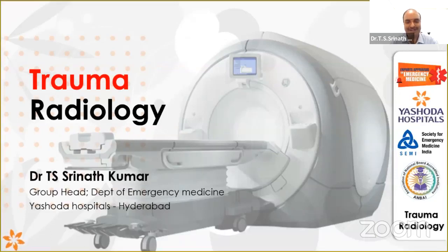But what is important for us is, after all these things, what next? Because we are emergency physicians, we should know what next we have to do, how to stabilize the patient, what things we have to do next. The progressive use of contrast enhanced CT allowed for a better assessment. I'll give an example. We had a polytrauma patient last week. There was a dilemma whether this patient should proceed with a normal CT or a contrast enhanced CT. But we went on and did a contrast enhanced CT, and we could see the difference between plain CT and contrast enhanced CT because there was a splenic rupture.